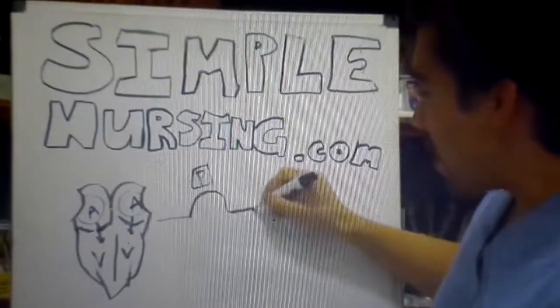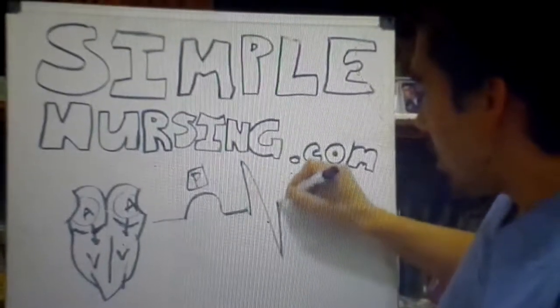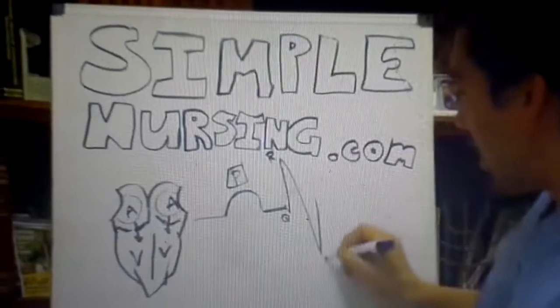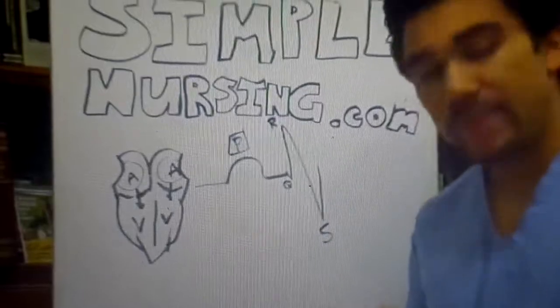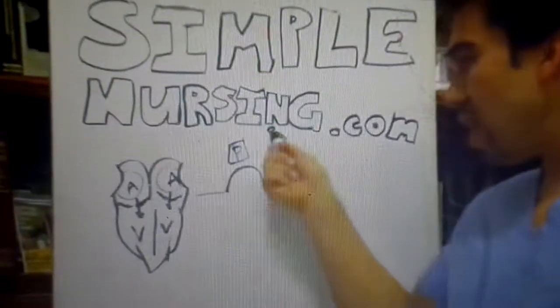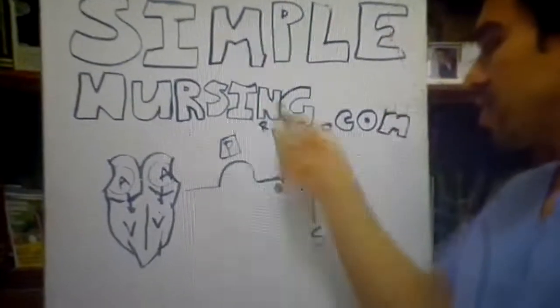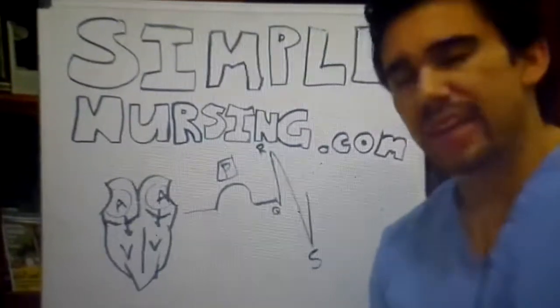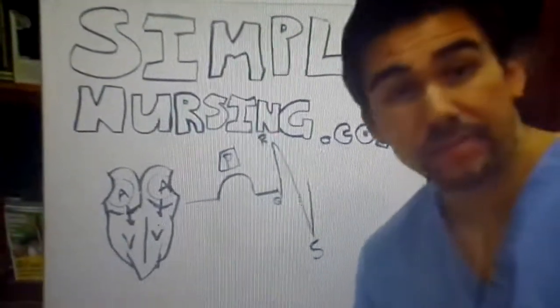And that's what shows up as our QRS, okay? QRS. And I'm not sure if I'm really writing that big enough for you guys, but QRS. Now, in EKG terminology, the QRS is your ventricle depolarization. And everyone's like, oh my gosh, crazy words. Why are you using so many big words? And all it really means is the ventricle squeezing, okay?